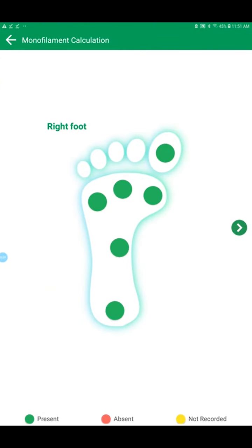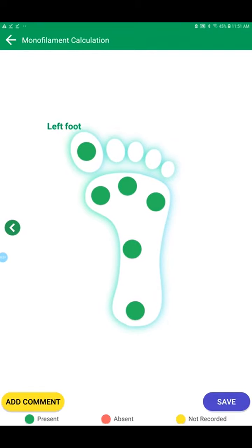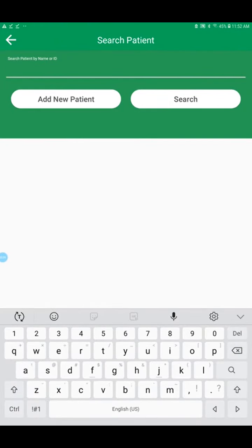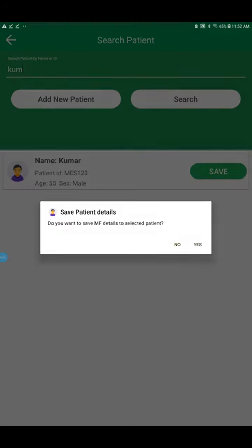I am assuming all the values are now green. Green means, at the bottom you can see, green present, red absent, yellow not recorded. So I am checking with the monofilament. On the first metatarsal the patient has not felt it. I just touched it, and it becomes 0. On the other foot, the patient is feeling the sense in all the 6 points. So I am just saving it now. Okay, so search, then save.